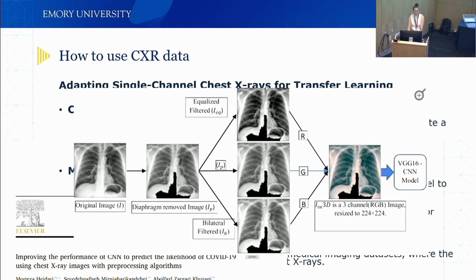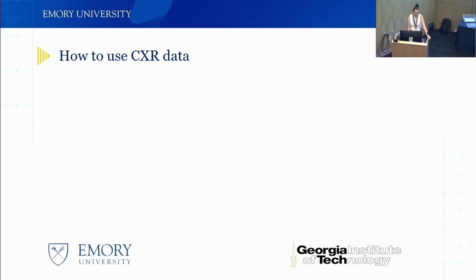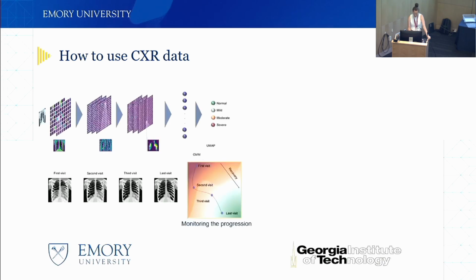So they create filtered images, and then use each filtered image as one of the RGB channels, and then because you get 3 values from each one, you get sort of a color-coded map, and then you have, again, an RGB image. But then your filter represents other things that might be more specific for what you're looking at.